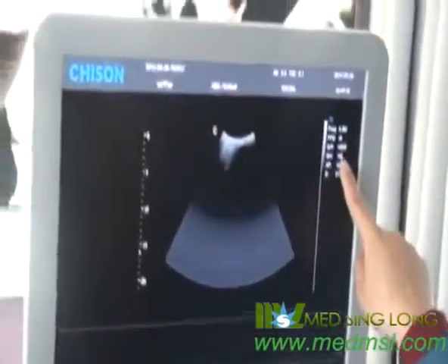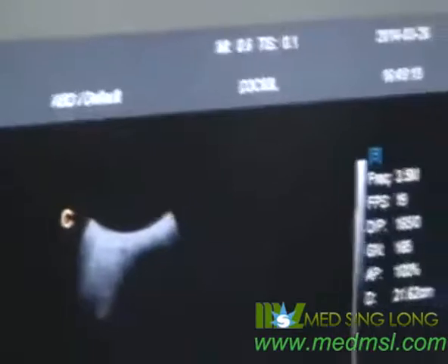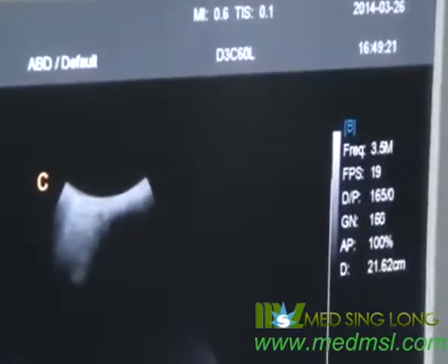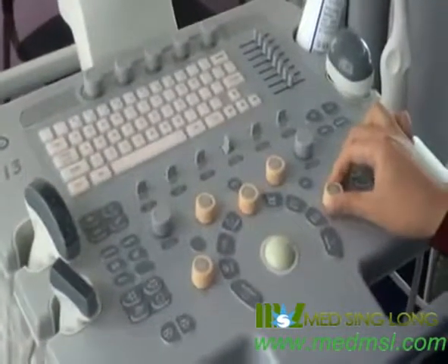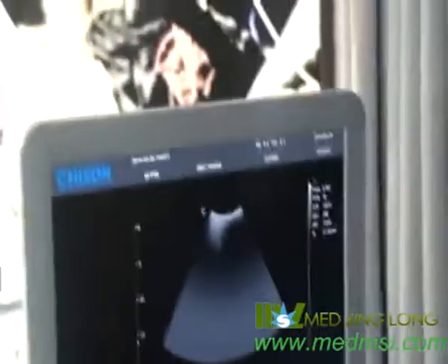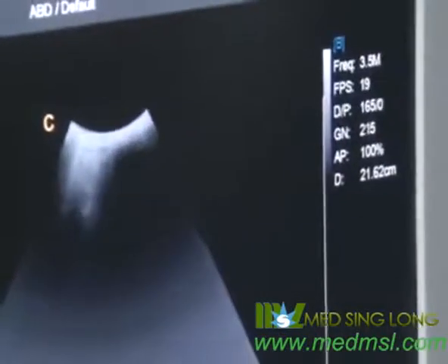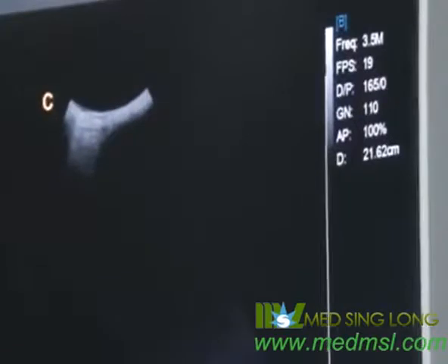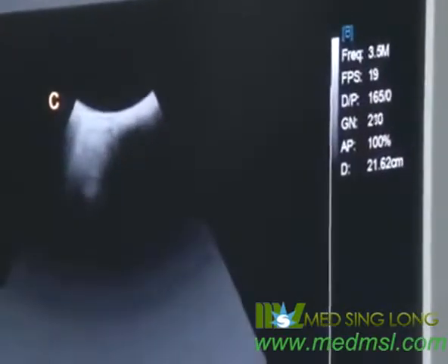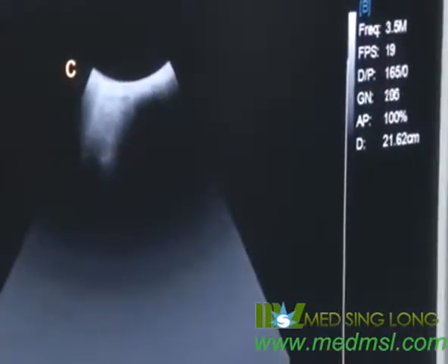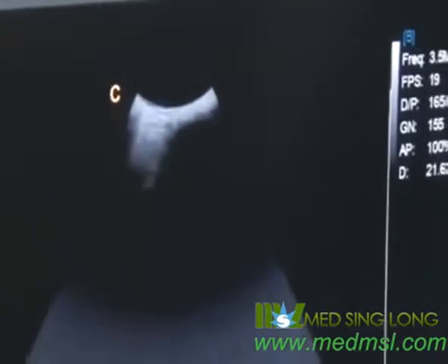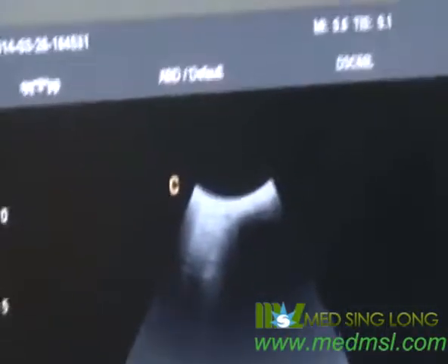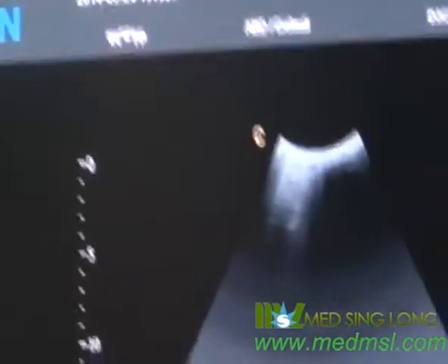For gain, rotate the B knob to adjust the gain. It will affect the image brightness — rotate to increase or decrease the brightness. These are the parameters in B mode.